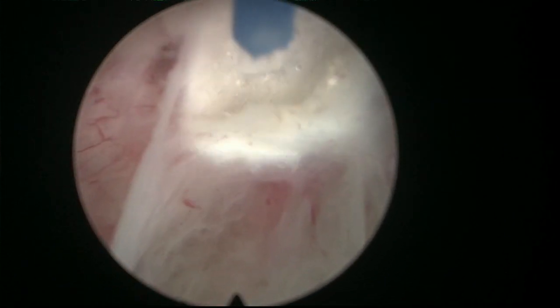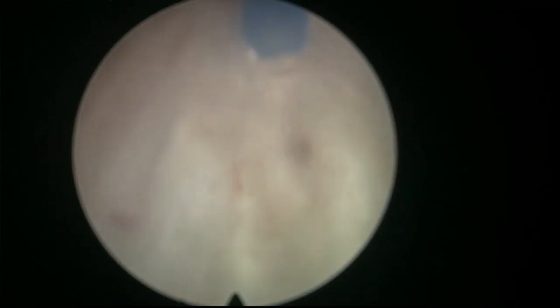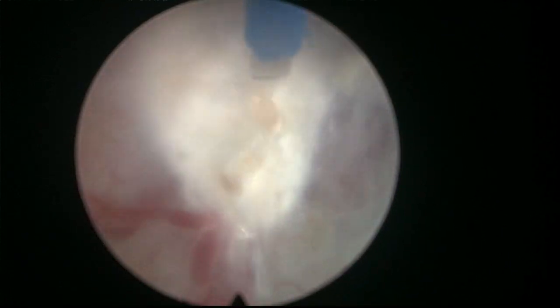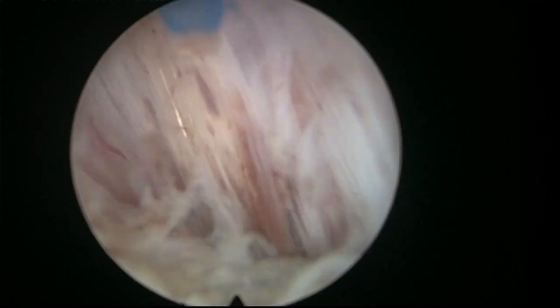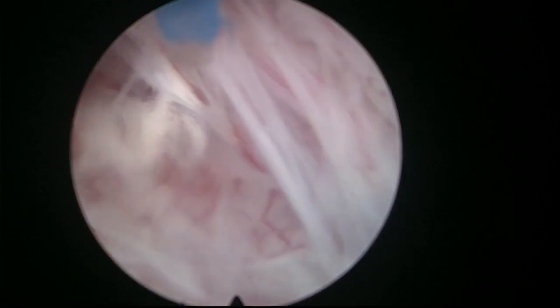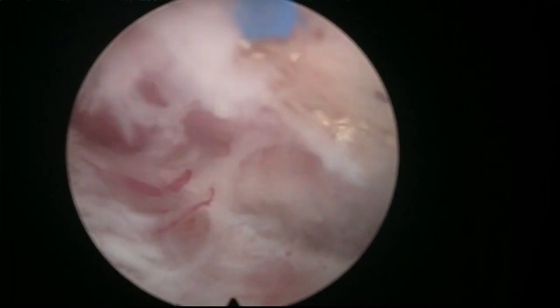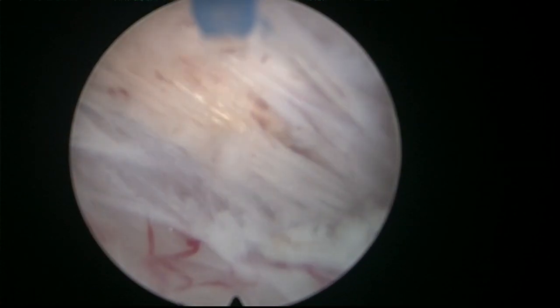There we are. That's very good. Now we are connecting. You see, this is a normal, let's say, view of the capsule. Some people say that anteriorly there's no good plane, but I disagree. I think sometimes you find a beautiful plane anteriorly as well.